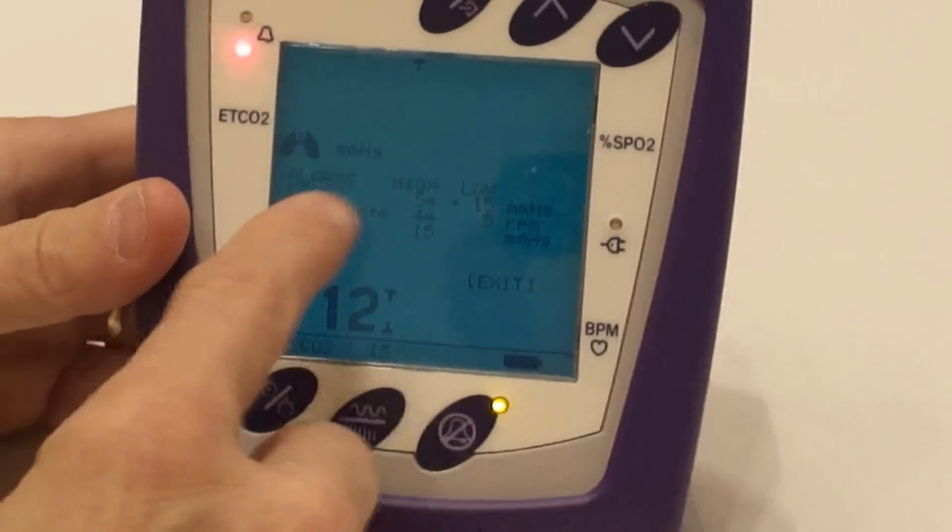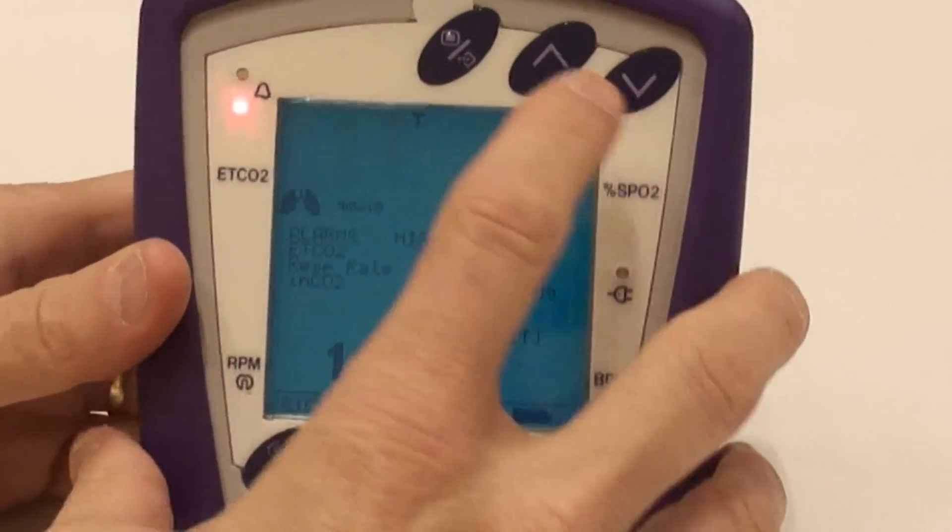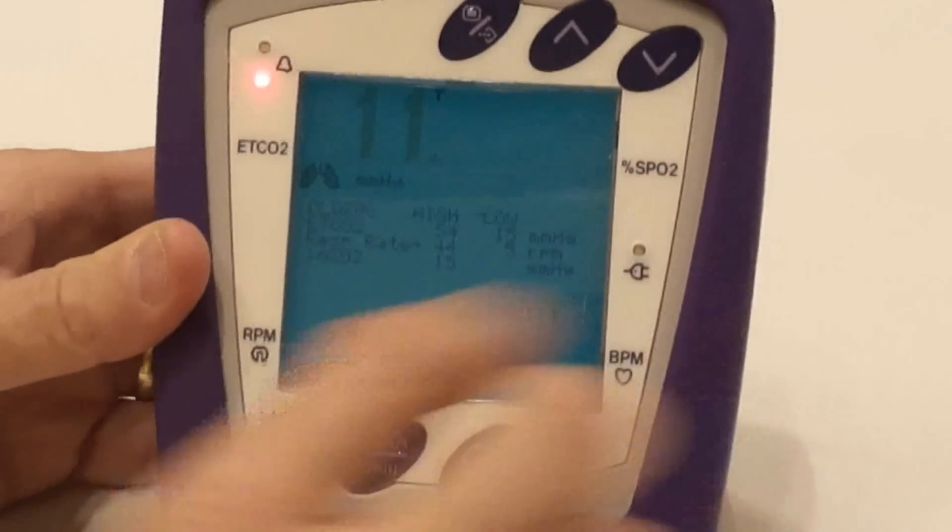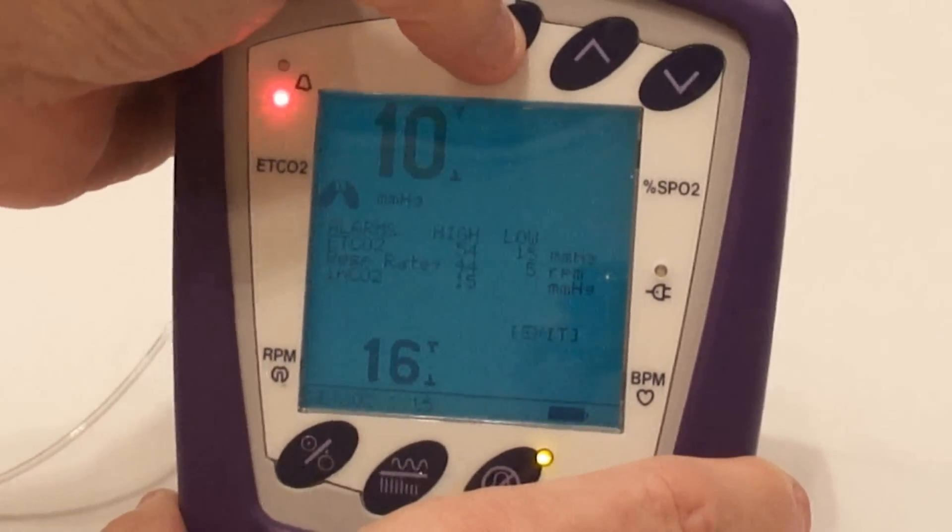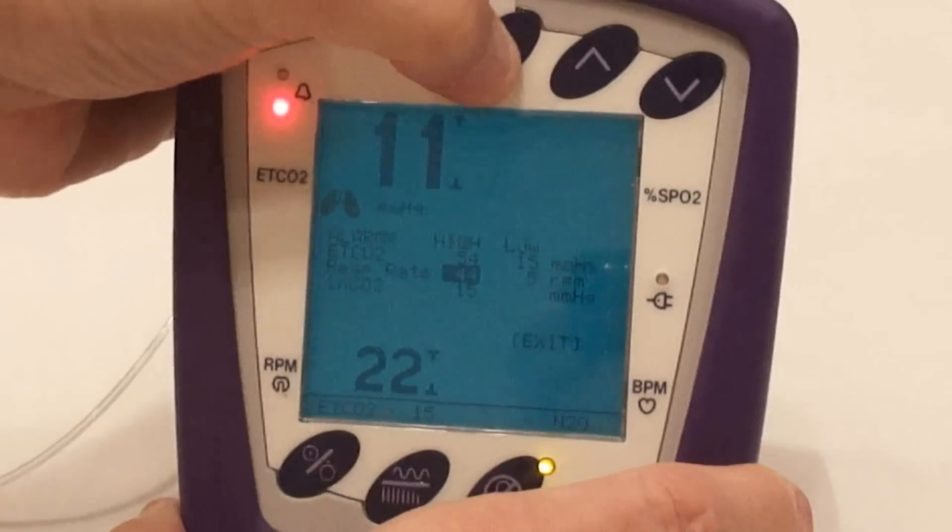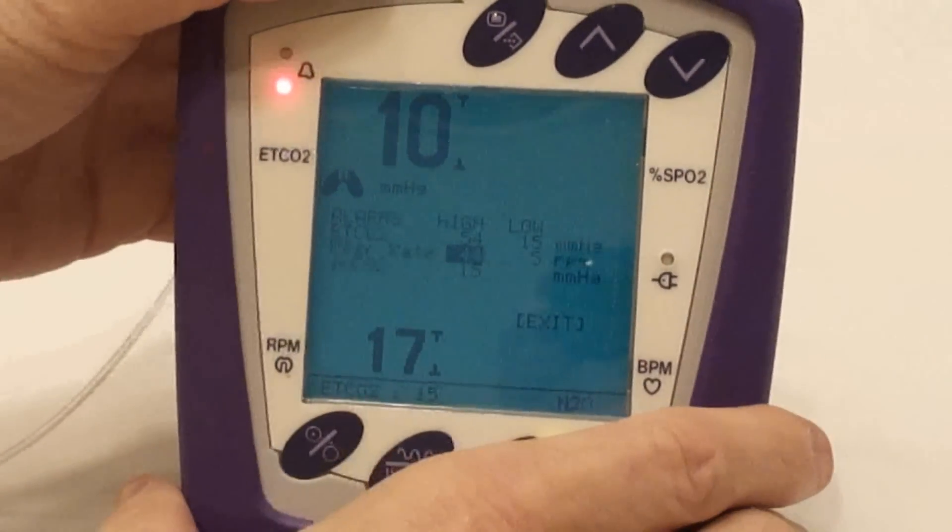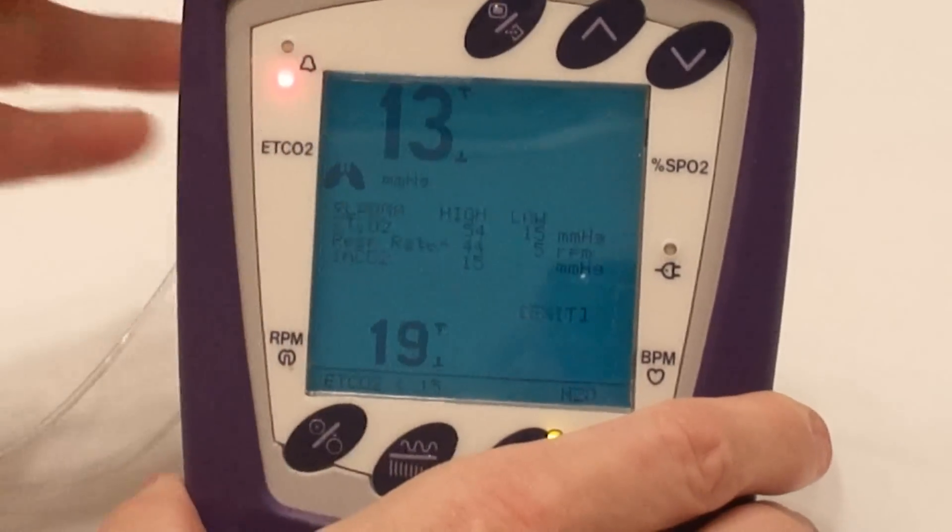Now we set the alarm settings for the end-tidal CO2. If we wanted to do respirations per minute, we would just go right down here to the next respiration rates per minute. Right now we've got the alarm set at 44. If we want to change that, we just press the menu button. Using the arrow key up or down, we can adjust it. Then once it's adjusted, press the menu button again and it's locked in.